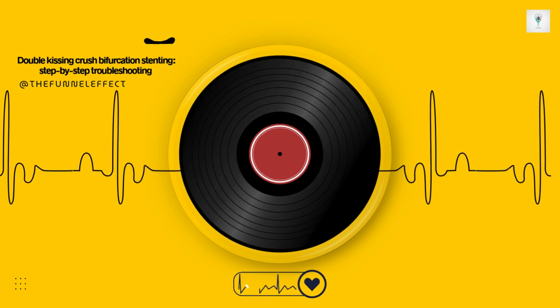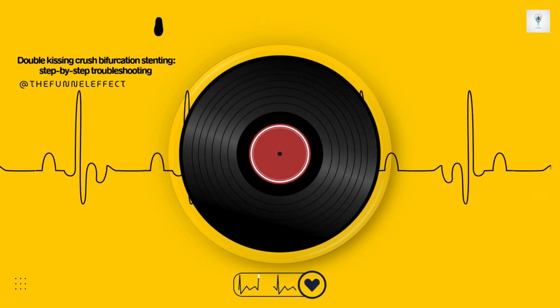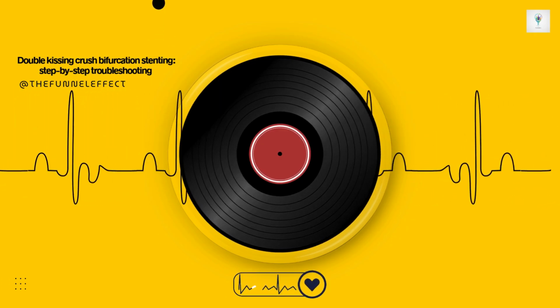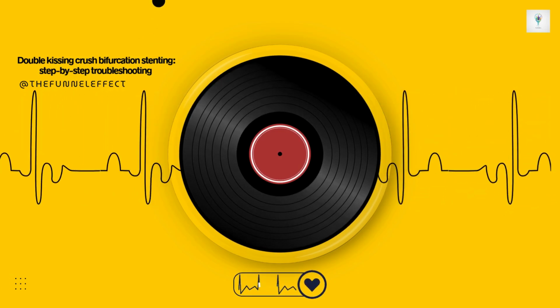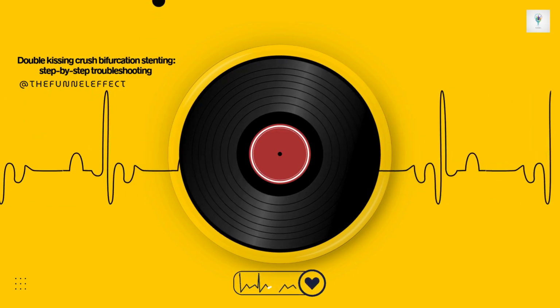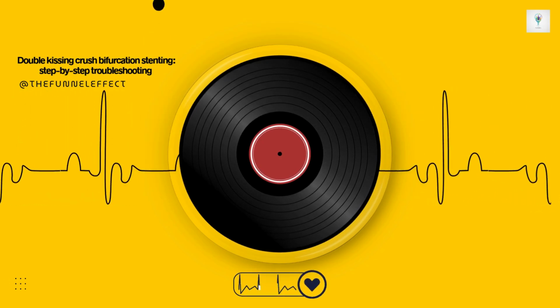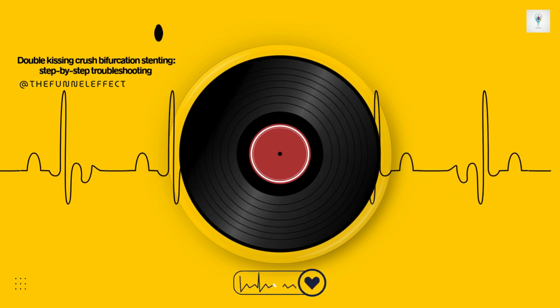Okay, let's say you get the stent delivered. Now the precision part. How much should it stick out into the main vessel? The source is quite specific on this. Yes. The target is a short protrusion, 2 to 3 millimeters into the MV. It's a real balancing act. Too short, say just 1 millimeter, and you risk completely missing the true ostium of the side branch when you deploy. That's a disaster. Too long, and you have excessive metal in the main vessel, which isn't ideal either. So if you have to choose, it's generally better to err slightly on the side of a bit longer, maybe 3-4 millimeters, rather than risk being too short and missing the target.